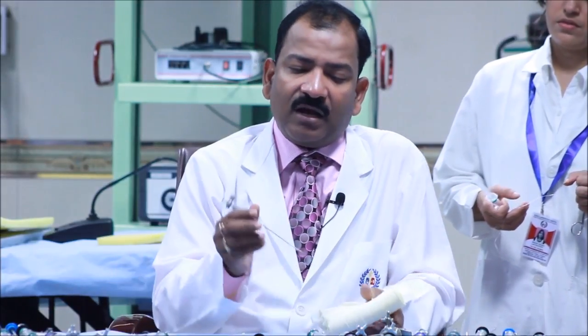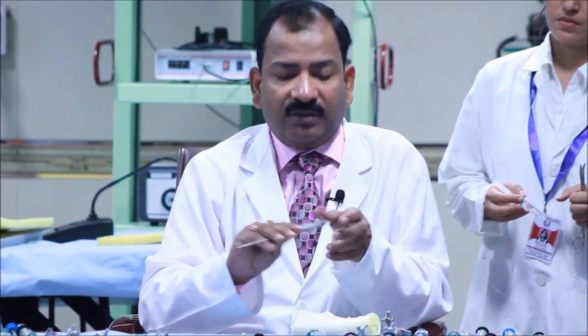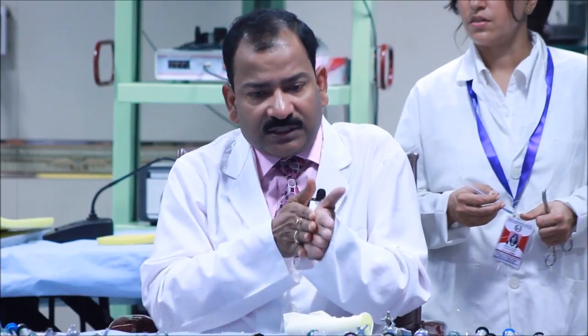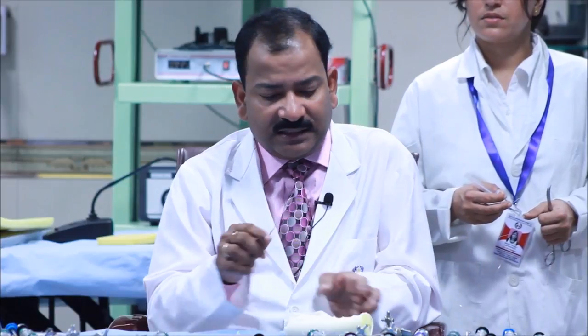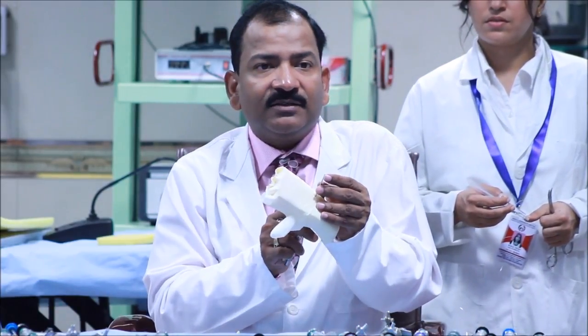What do we get to know from the first irrigation test? Irrigation test has two advantages. One advantage is that the eye of the Veress needle is always on the side. So during introduction, once this blunt tip, this is blunt, this is not sharp, comes out, the eye of the Veress needle sometimes catches some soft tissue or fat. Once you irrigate it, it gets flushed out.